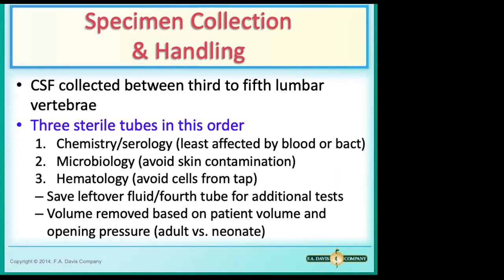The specimens have to be collected in 3 sterile tubes. These tubes are labeled 1, 2, and 3 in the order in which they are withdrawn.